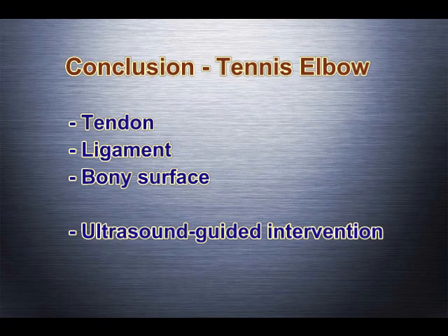In conclusion, tennis elbow is not simply tendinitis of the extensor tendon. A careful and detailed sonographic examination of the extensor tendon, ligament, and the bony structure is extremely helpful to make a precise diagnosis and lead to proper treatment for tennis elbow.